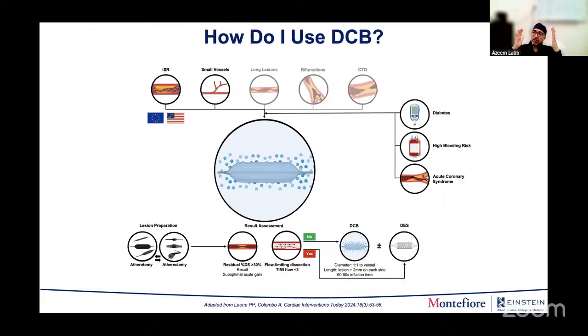It's to get it to start moving into the vessel wall, so that when you deflate the balloon, it doesn't completely wash away. Because if it was just like a powder you put onto the vessel wall, and then suddenly you deflate, that's just going to wash away. So by keeping it inflated, you're stopping blood from having contact with the drug excipient combination, and you're allowing time for the drug to dissolve, or the drug excipient combination, or the microparticles, nanoparticles if you're using sirolimus, to actually start moving into the vessel wall already.